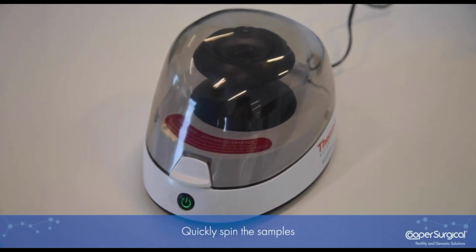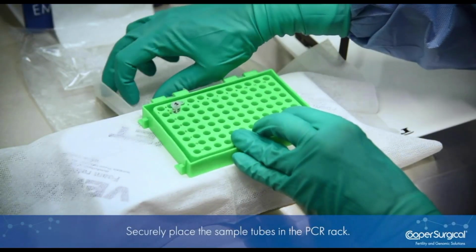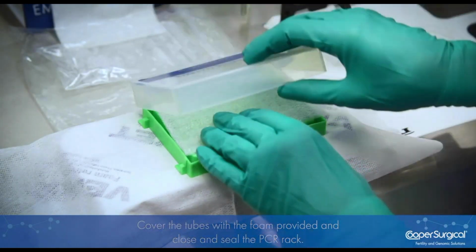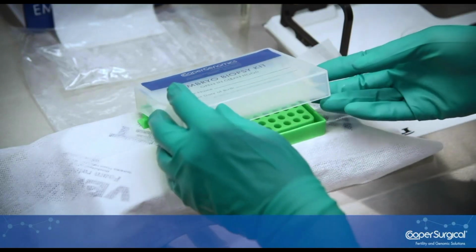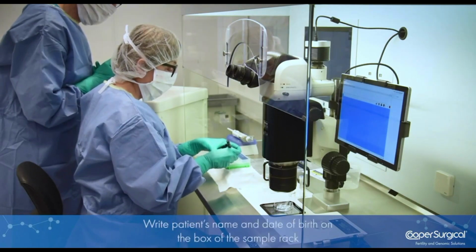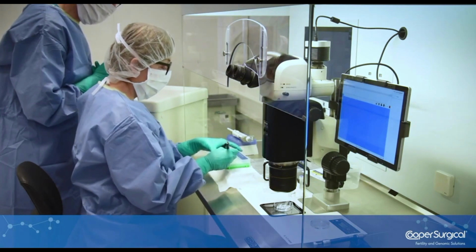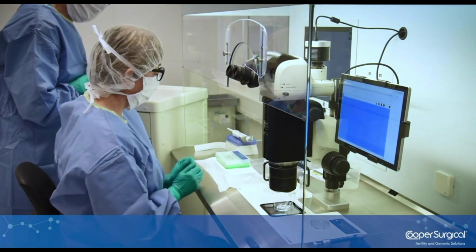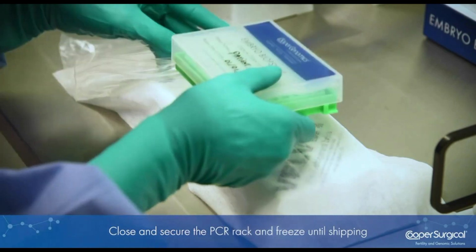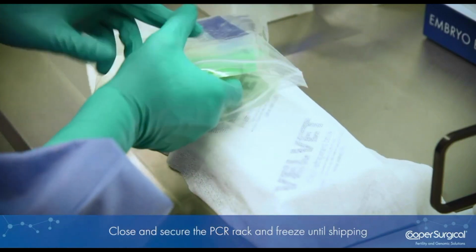We will then quickly spin these tubes in a mini centrifuge, place them in the tube rack, close the tube rack so that the tube sample doesn't move, and then we will write the name of the patient and the date of birth on that specific box. The witness, of course, will double check that this is correct, and then we will introduce and pack the box, and this one then will go to the freezer.